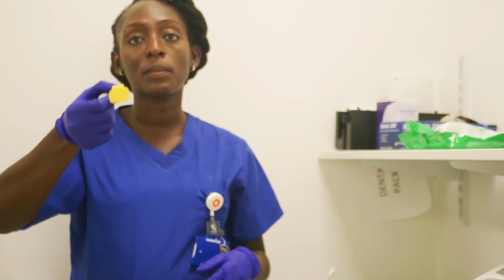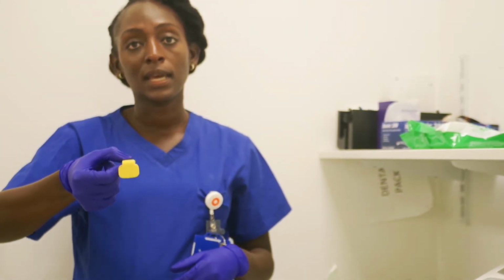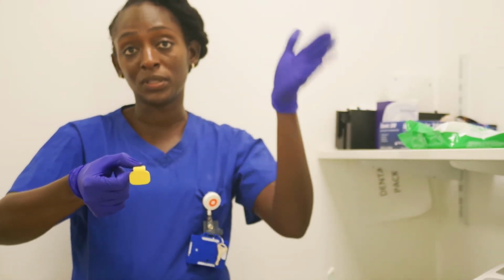Okay, so the first setup was for the lower right 6. Now let's set up for the lower left 6. Same as before, you'd hold the bite piece or the bite block down like that. And which side will be the left side? It will be this side because that's my left hand.